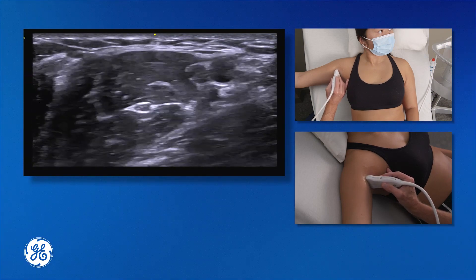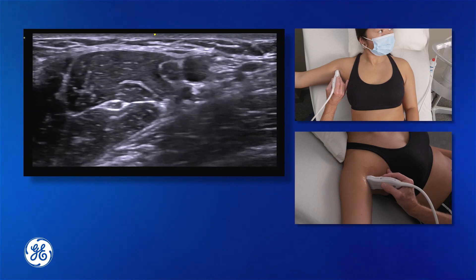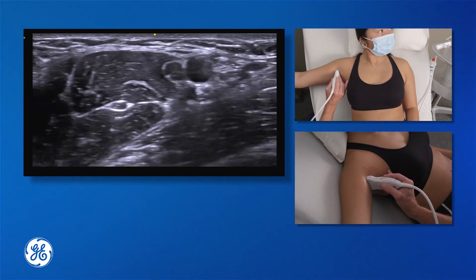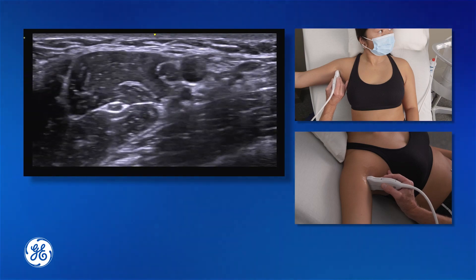This nerve is part of the lateral cord. So if you don't see it as we can see it here, then using the nerve stimulator, I would stimulate around the median nerve and see if you get that classic elbow biceps twitch, which is going to show you that that is musculocutaneous — still connected to the median nerve as a low-lying lateral cord.